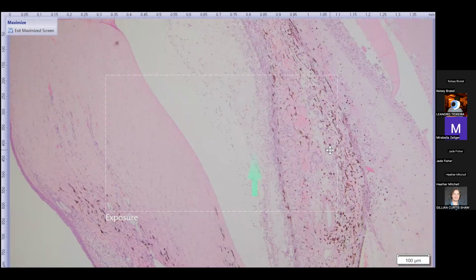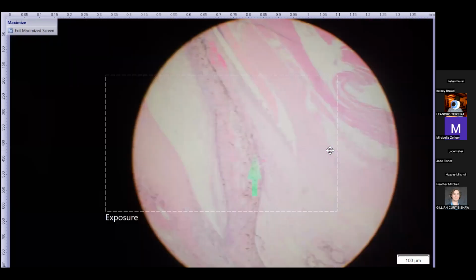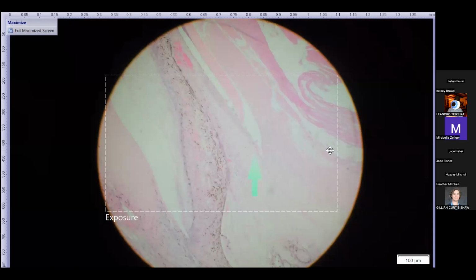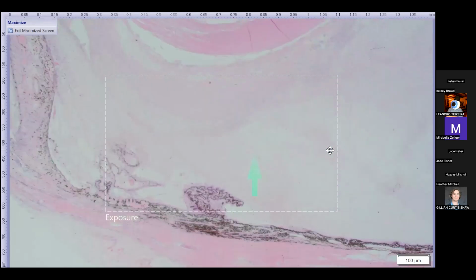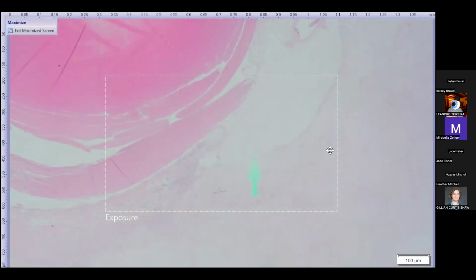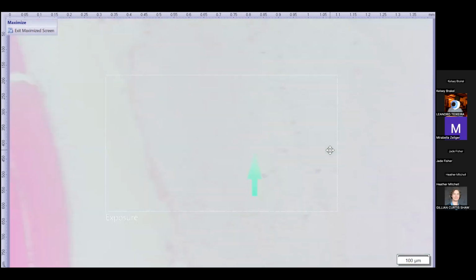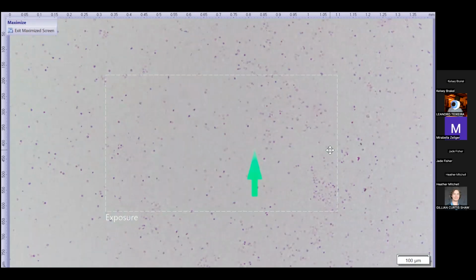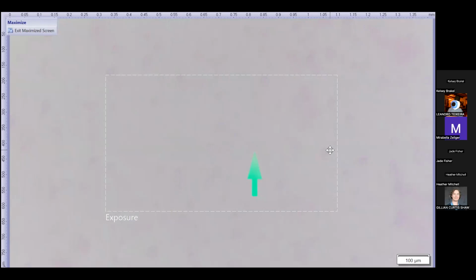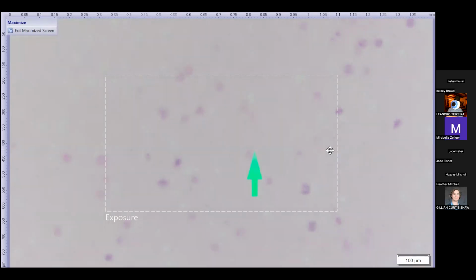And so there's exudate in the anterior chamber, exudate in the posterior chamber, and the vitreous. And the lens capsule is actually multifocally discontinuous. So you can see one end of that lens capsule is present there as well. So this lens capsule was ruptured multifocally, or penetrated multifocally, if we're going to blame the cat. The vitreal exudate is more just proteinaceous with a smaller number of inflammatory cells and fibrin. All of the subtle fibrillar eosinophilic material in the background here is fibrin.